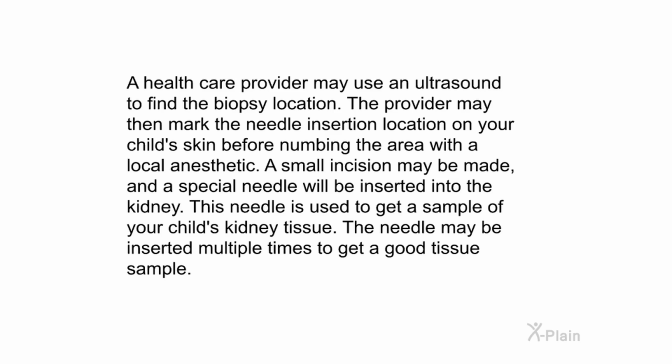A healthcare provider may use an ultrasound to find the biopsy location. The provider may then mark the needle insertion location on your child's skin before numbing the area with a local anesthetic. A small incision may be made, and a special needle will be inserted into the kidney. This needle is used to get a sample of your child's kidney tissue. The needle may be inserted multiple times to get a good tissue sample.